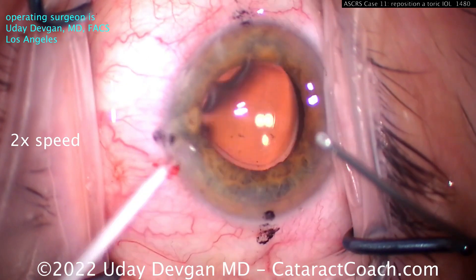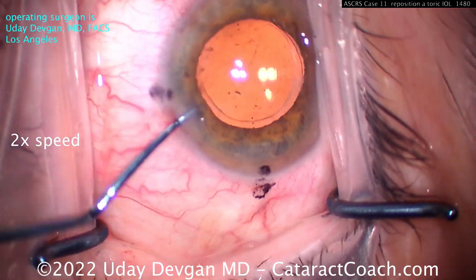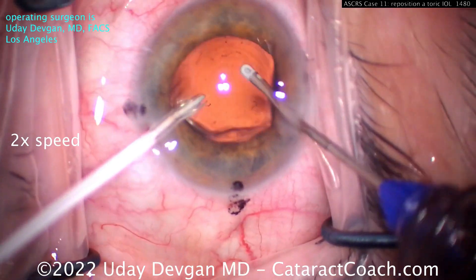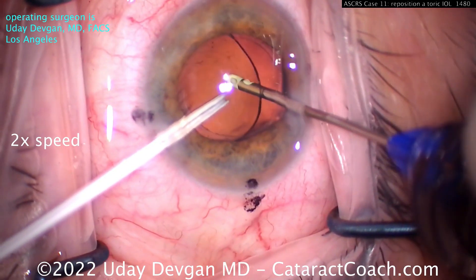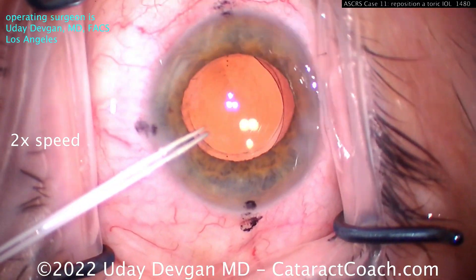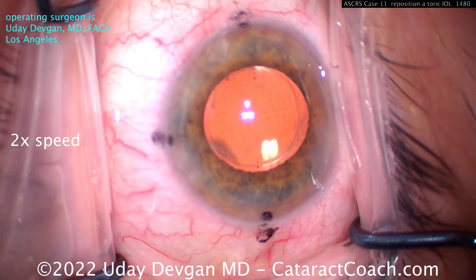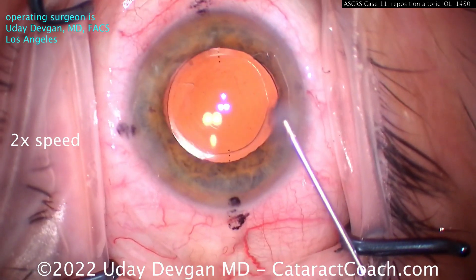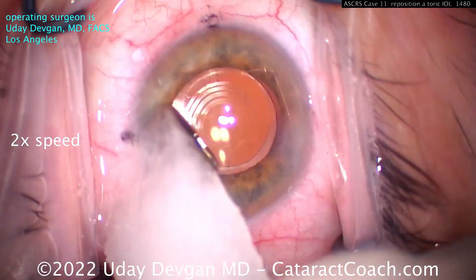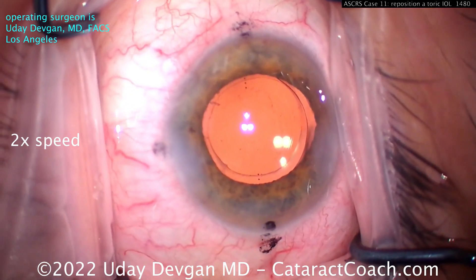The correct meridian is here at the 180 meridian. We're going to do a bimanual IA. Once we get the lens in good position, verify its orientation. The right hand is the aspirator from the transformer handpiece, going behind the optic to remove viscoelastic. The left hand is a 23 or 25-gauge IV cannula used as infusion. That looks great — rotated using only two paracenteses, a very effective and efficient surgery. Ensure water-tightness of the incisions at the end.